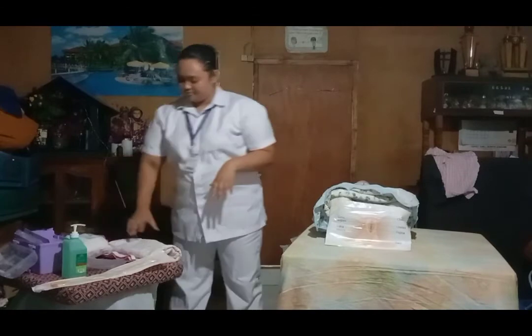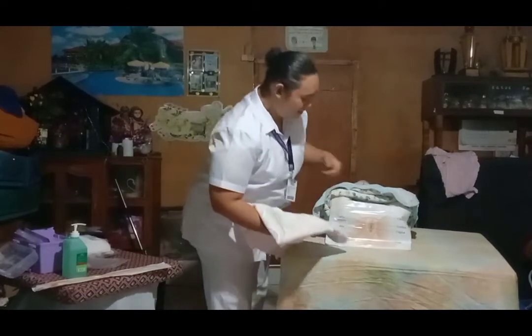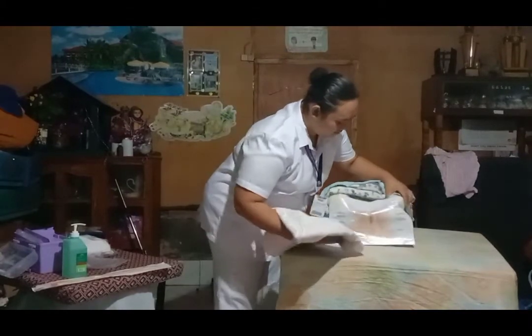And I'm going to place a pad underneath so that we can protect the bed linen from getting soiled, okay? So lift your buttocks, ma'am. Okay, I will help you with that.